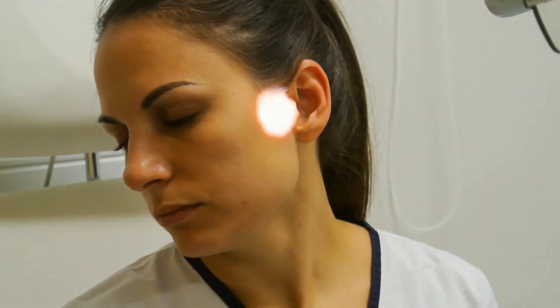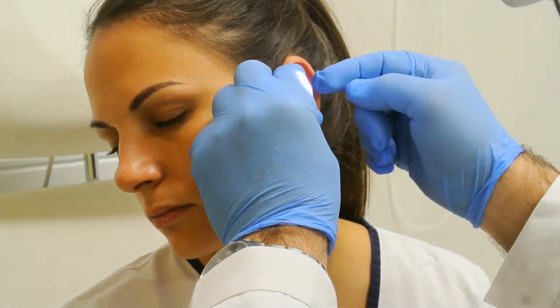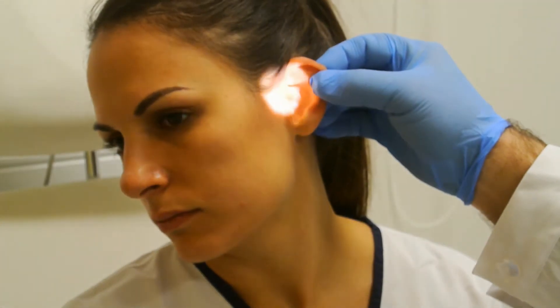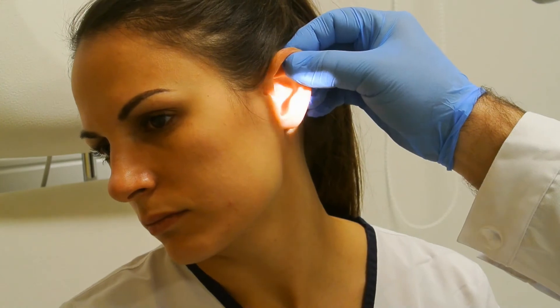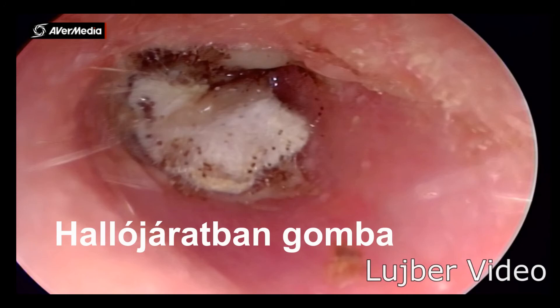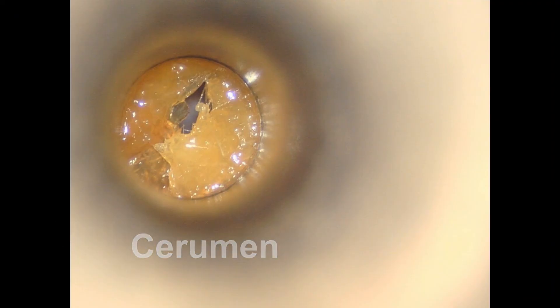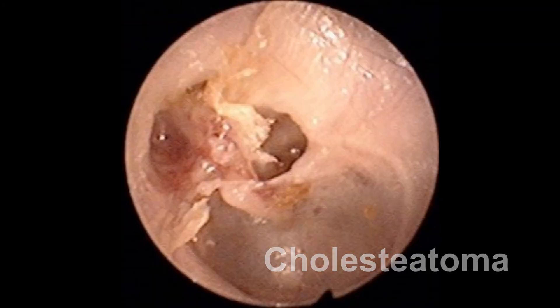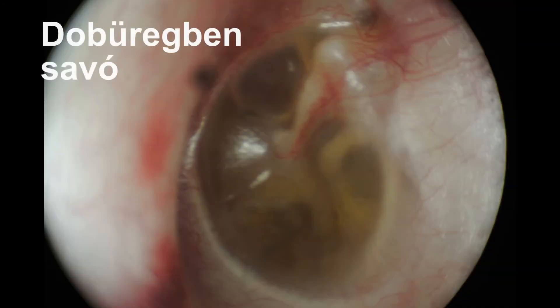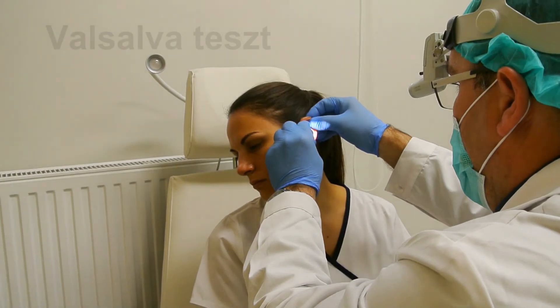Before introducing the ear funnel again, we should check the entrance of the ear canal for lesions such as folliculitis. We should also pull the pinna up and backwards and check the external ear for fungal infections or wax. We can also visualize cholesteatoma, effusion in the middle ear, or different types of tympanic membrane abnormalities such as perforation.